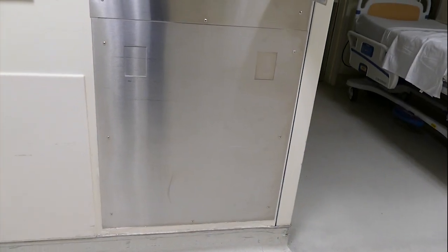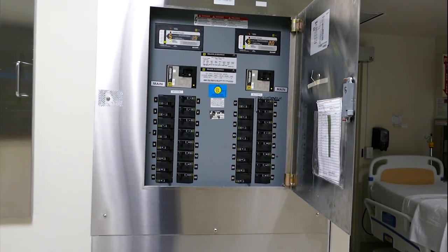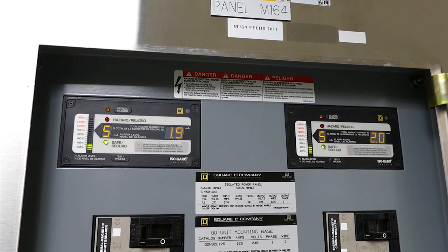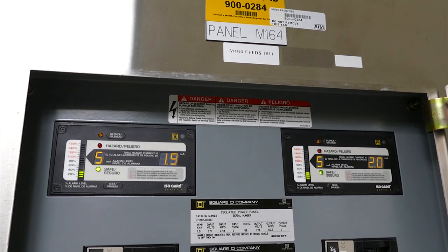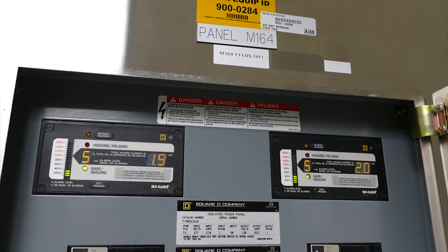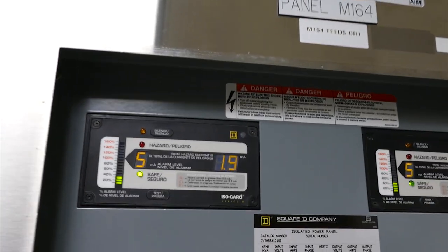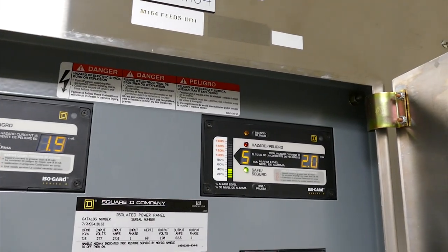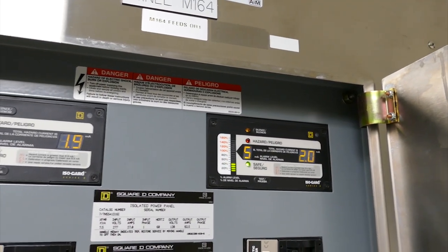So there's two transformers down there and the secondaries feed up here. What you have is these meters up at the top. They measure from the secondaries to ground and they display the amount of milliamps of current. You can see right there it's 1.9 and 2 milliamps.